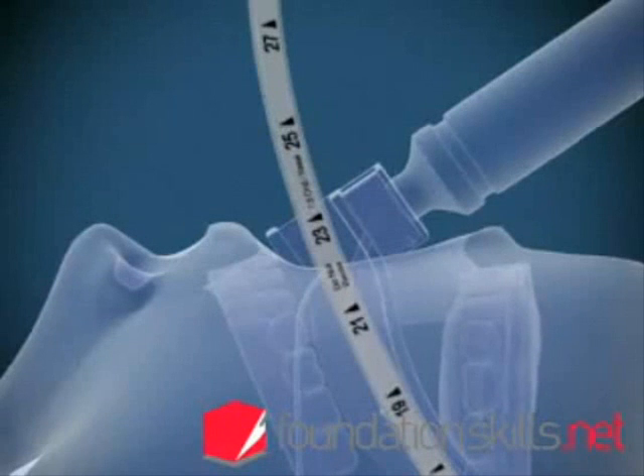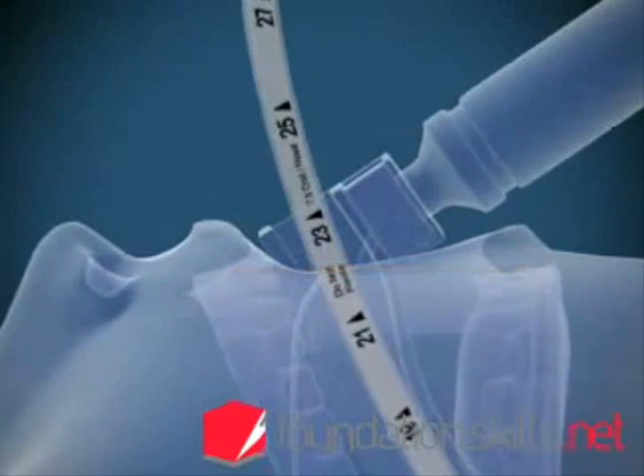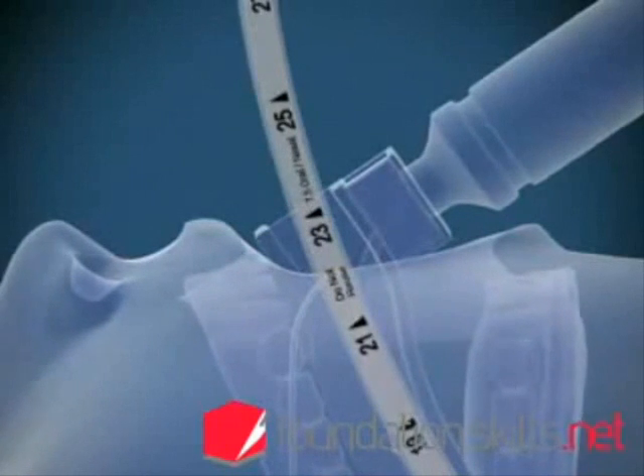The markings on the tube at the incisors will show between 21 and 24 centimetres in the average sized adult when the tube is in position.